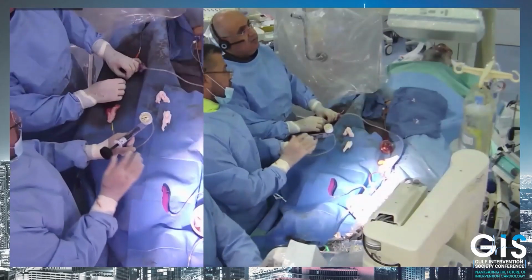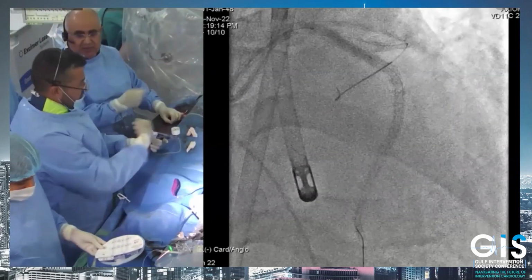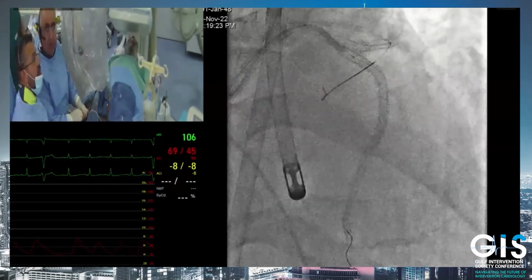Okay, again here, please. We'll do some more pressure here. 16, 18. Actually, the balloon is very good. Amazing. It moves really easily. The balloon, I can feel it. I can't agree more. Down, please. Okay, open up, please. The 4, please.